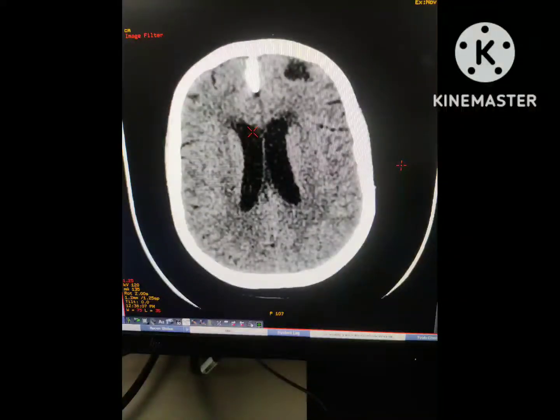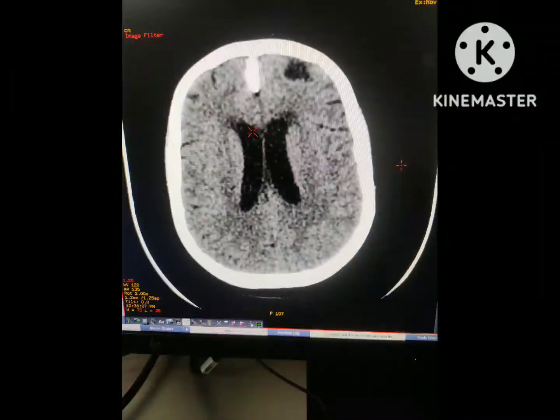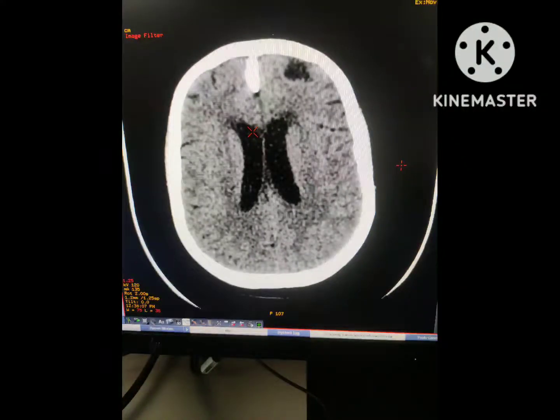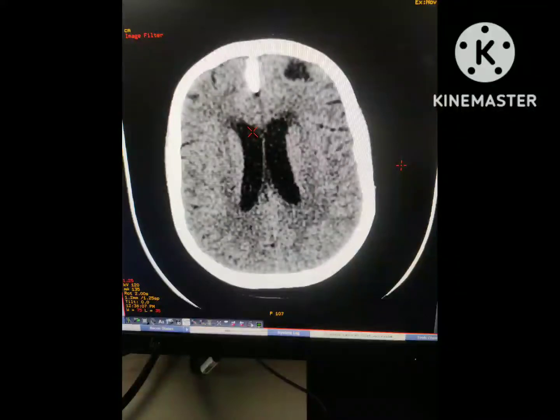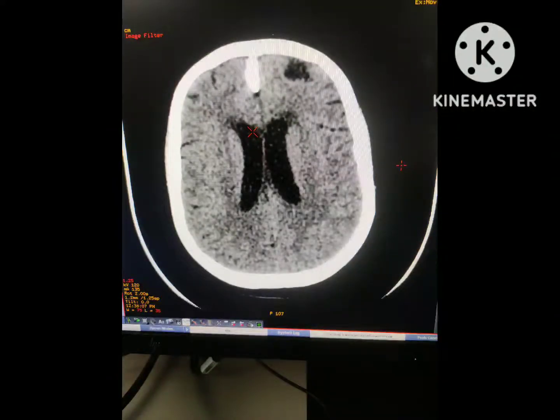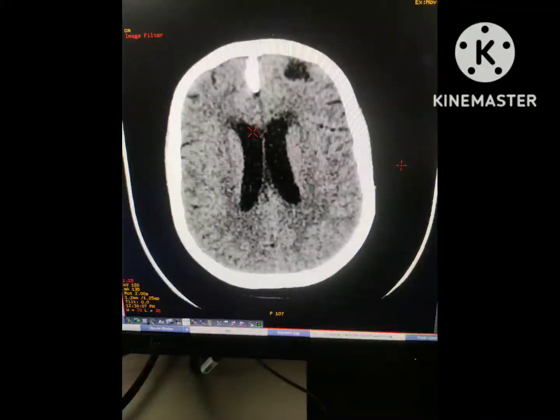Falx calcification is of two types: type 1 and type 2. Type 1 falx calcification is something like an osteophyte and it is in continuity with the underlying calvarium, while type 2 is an isolated one and has no continuation with the calvarium. Depending on the location, it may be entirely superiorly located or posteriorly located in the falx cerebri.